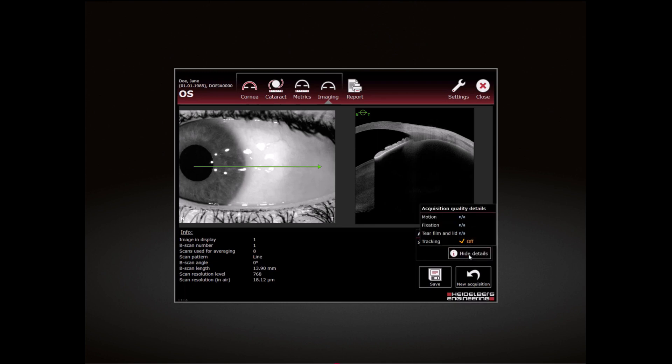The acquisition quality parameters motion, fixation and tear film and lid are not applicable and are indicated as NA and tracking off is displayed.